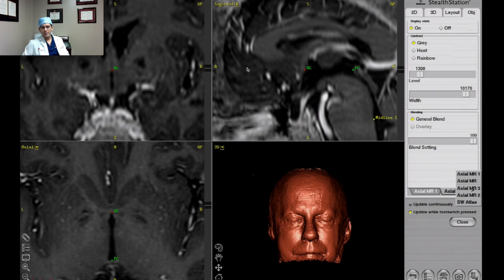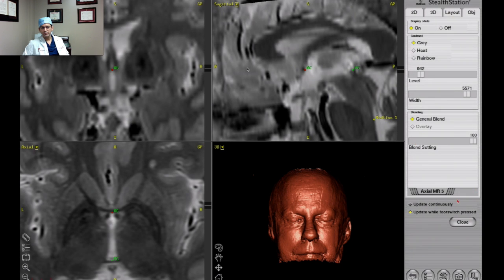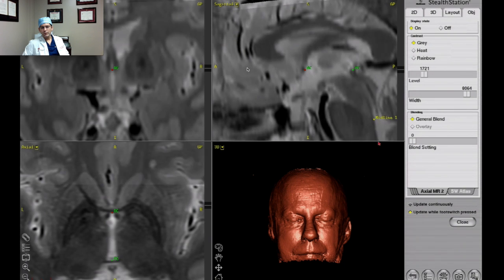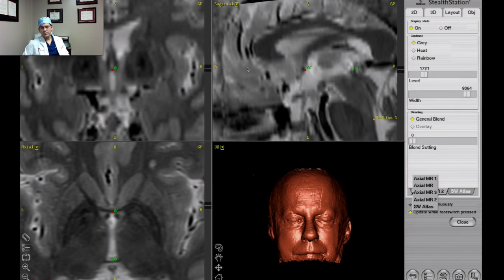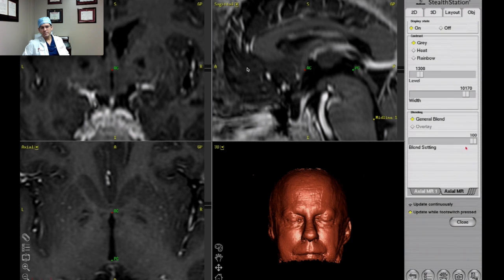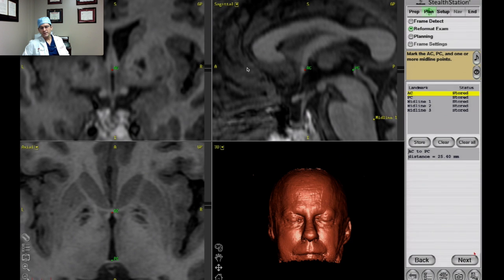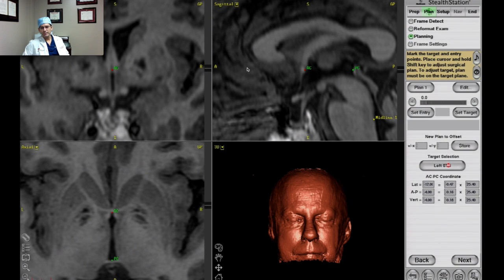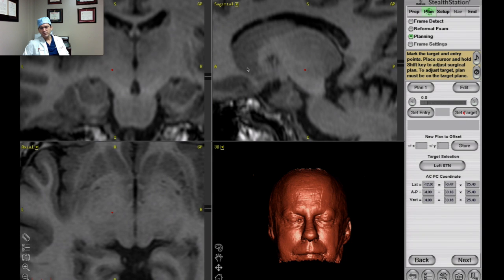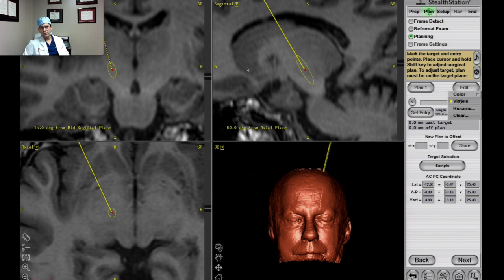Now I've reformatted the imaging. What I'm doing here is turning on all those different MRIs and making sure that AC and PC match. This is the step where I'm making sure that we have good co-registration.